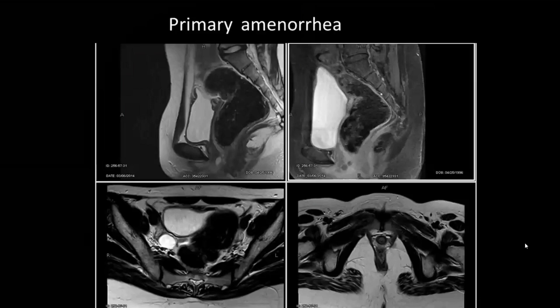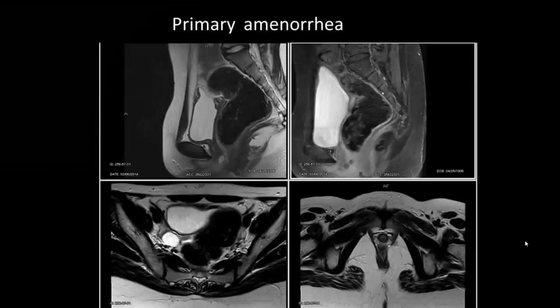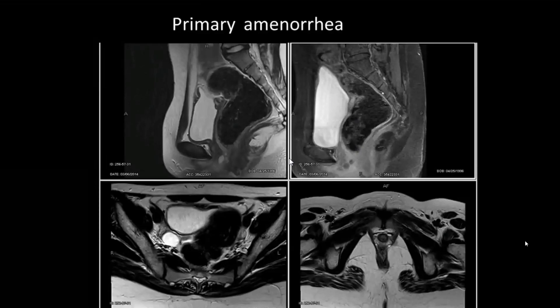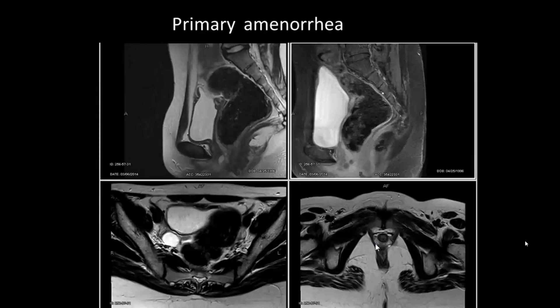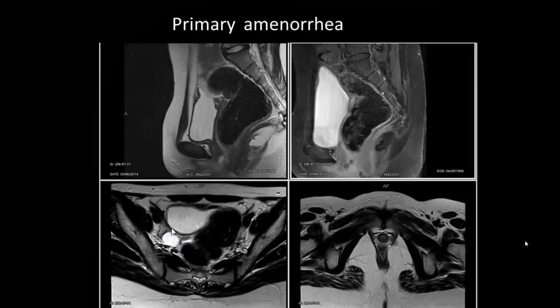Primary amenorrhea — the history is very suggestive. We don't see the vagina. Whenever you have this clinical indication, first look for the vagina; the best section is the axial T2. In this case, you don't see the vagina — you see the urethra and anal opening. On sagittal sections, the uterus is also not visualized, but we do see an ovary. This is a case of congenital absence of uterus and vagina — Mayer-Rokitansky syndrome.